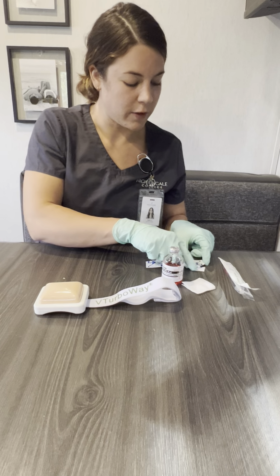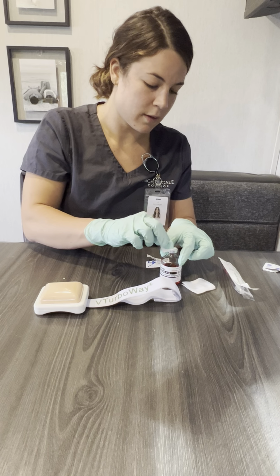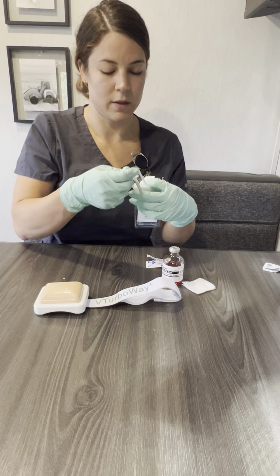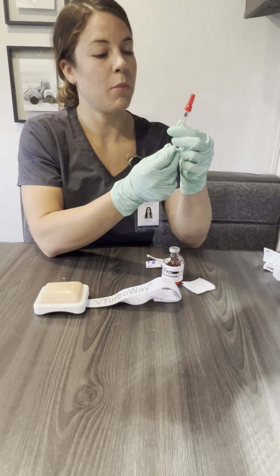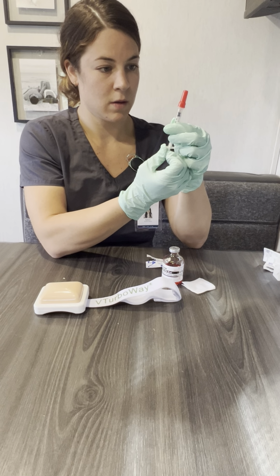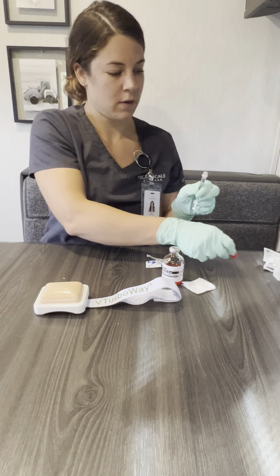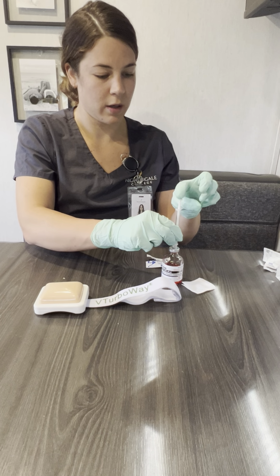Alrighty, so first thing I'm going to do is clean the vial. Alright, and then with my tuberculin syringe, I'm going to take it out. I'm going to withdraw 0.1 mLs of air. It's my 0.1 ml of air. I will take the lid off, inject the air into here.